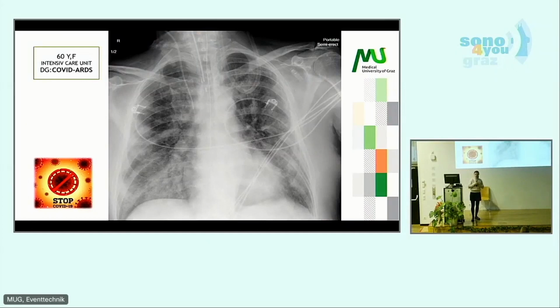So it's the standard patient that I get early in the morning, to compare the examinations, to talk to the anesthesiologist, and to try to figure out whether something is better or worse in her condition. The X-ray looks like this. There are multiple shadows. I cannot say whether there is pleural effusion or not. Hopefully I will have an examination, and I will stick to it.